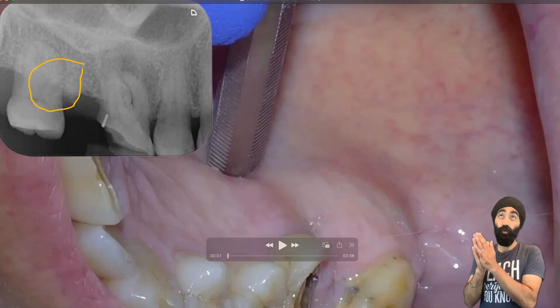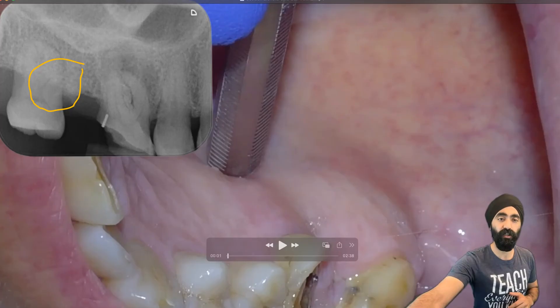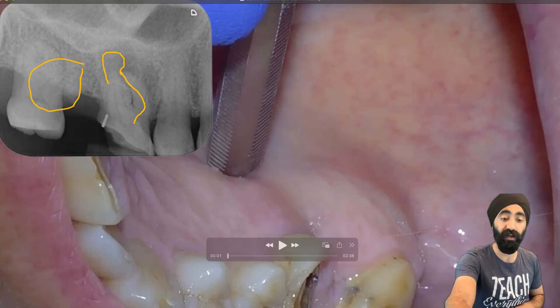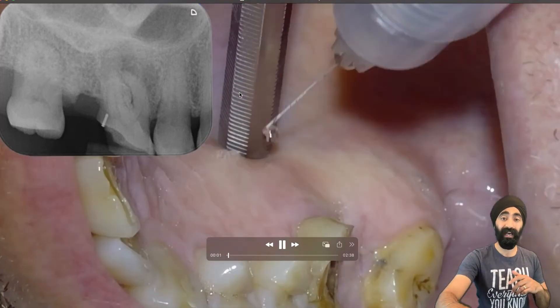What makes this tooth removal challenging, and why I sectioned and elevated, is because I knew that it had this curved root over here, and I was suspecting a bulbosity of the root there. So I chose that because there's not much of the tooth to grip onto — especially as you'll see shortly, there was a fracture — I chose to section and elevate.